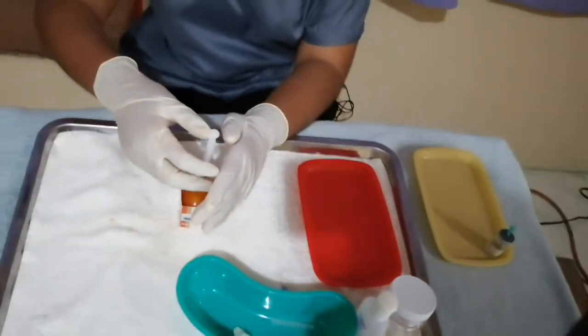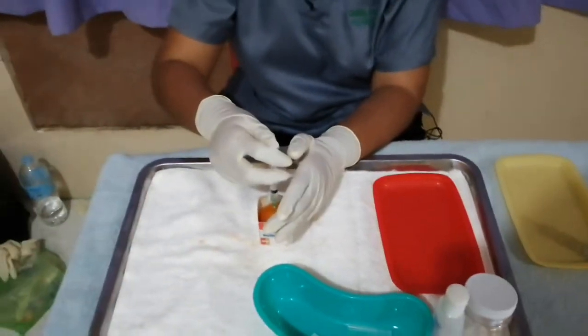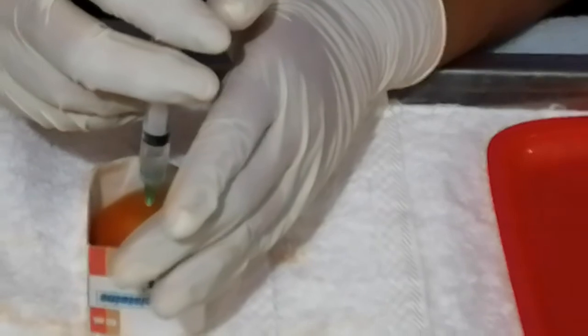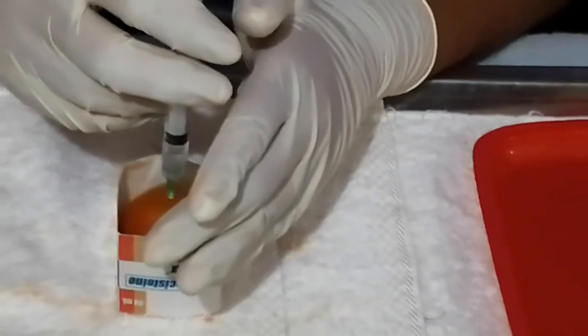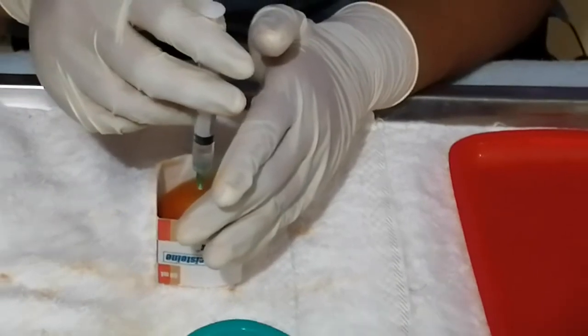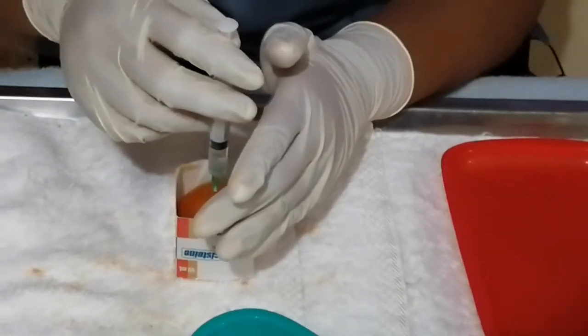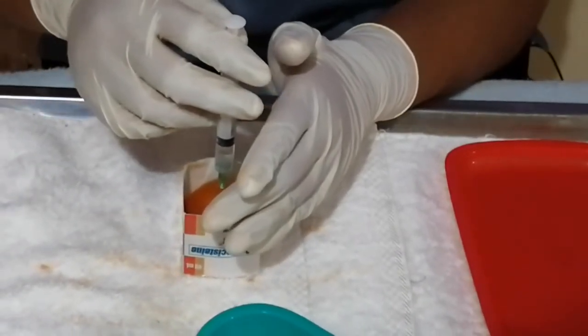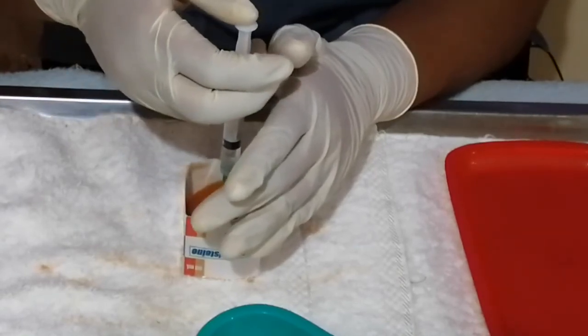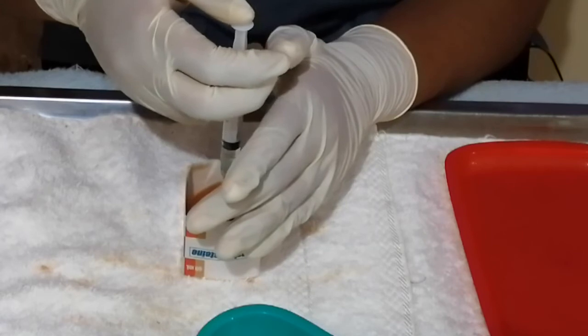After that, we're going to pull the plunger, and if there is no blood coming up into the needle or the syringe, then we can proceed. But if you see blood, you're going to repeat the procedure and change the injection. Then we're going to slowly inject the medication into the patient muscle.